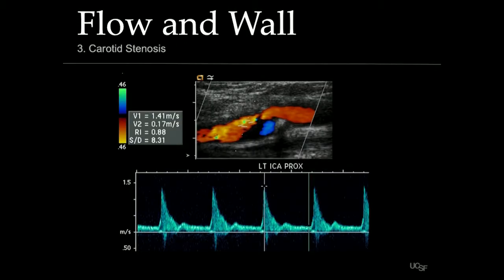Okay, to my third imperfect example, so right disease process, atherosclerosis of carotids, wrong modality, ultrasound. I walk very cautiously into this territory knowing that this is a very compelling topic for wall imaging, but just a passing observation as an observer to this type of imaging. I don't do it clinically, but little has changed practically in how carotid disease has been managed over the last 20 years or so. Carotid ultrasound really is still the first line of defense, and the exact same table that I used 15 years ago as a resident is still on the wall in the reading room and used. Generally what you do is you look at the degree of plaque and narrowing.